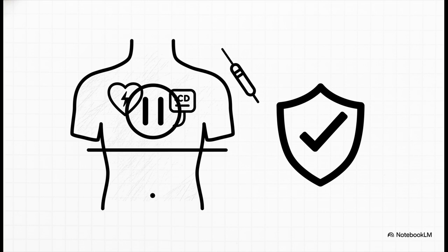This study gives us powerful, hard data that validates the ASA guidelines. A 7% risk is not trivial. That's a real chance of an inappropriate, painful, and hemodynamically significant shock. This is precisely why we use the umbilicus as a critical landmark. The data couldn't be clearer. For surgery with monopolar cautery above that line, you should suspend the ICD's shock therapies.